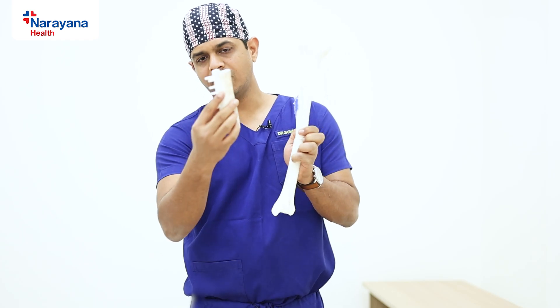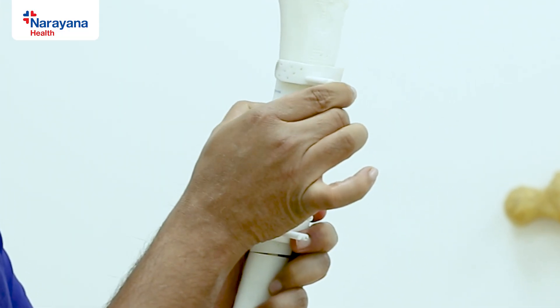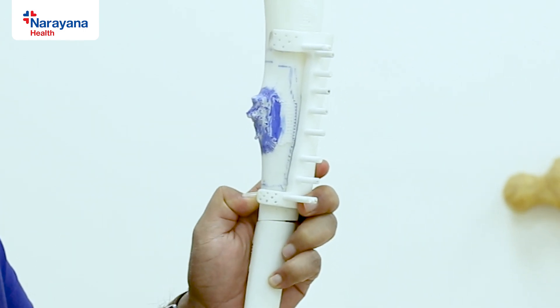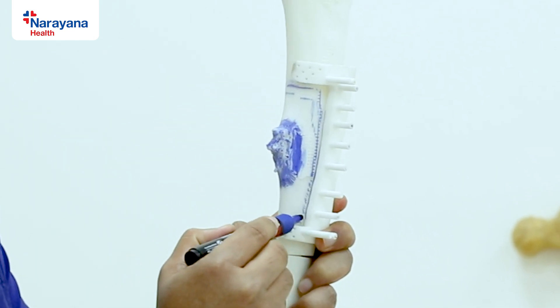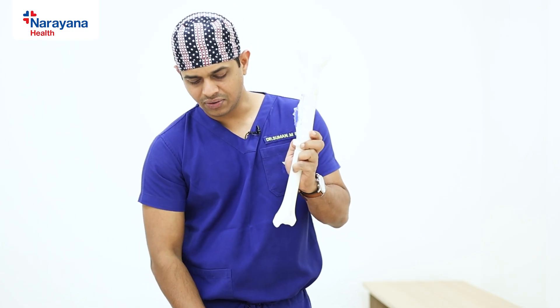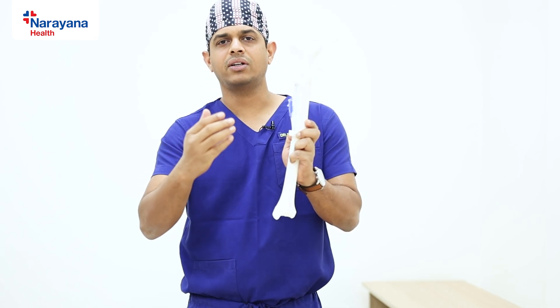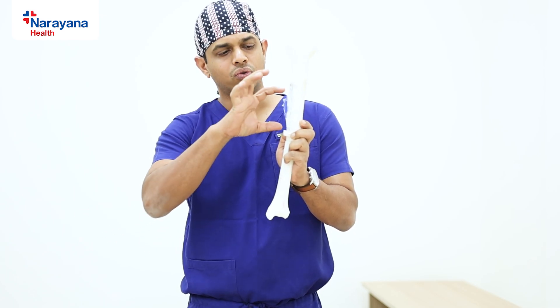This is the jig. This jig exactly fits into the tumor bone when we are doing the surgery. With the help of this jig, we can cut only a small window of the bone which is affected, instead of taking the entire bone and replacing it with artificial bone. After removing this small defect, it was reconstructed using the extra bone from the opposite leg to fill this area.